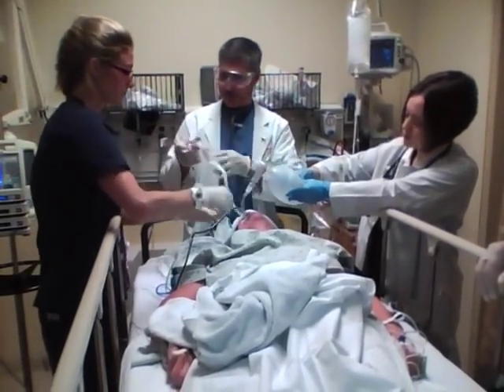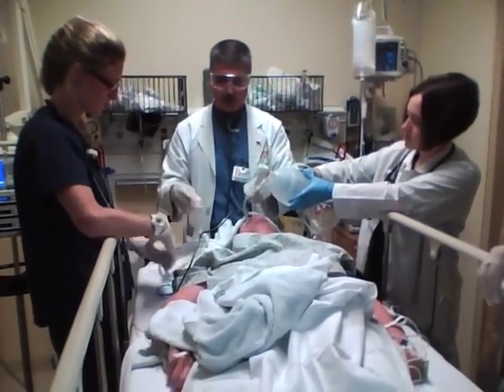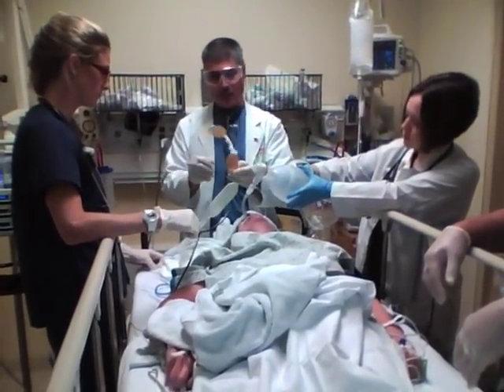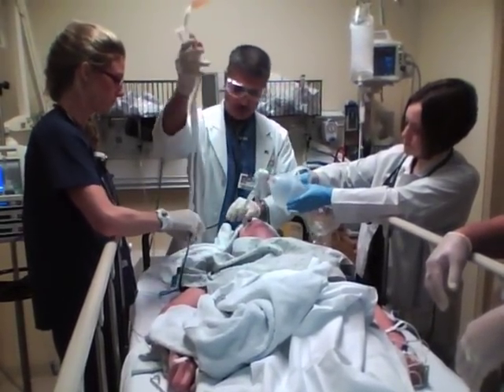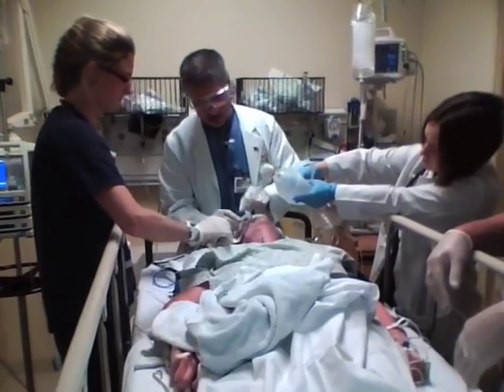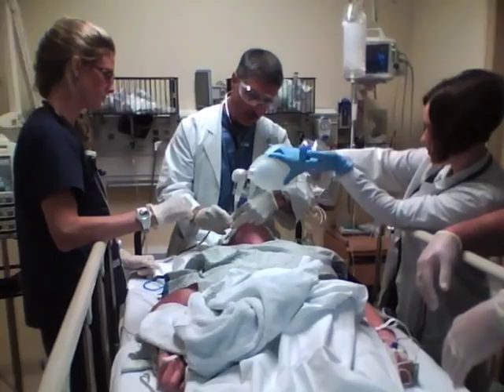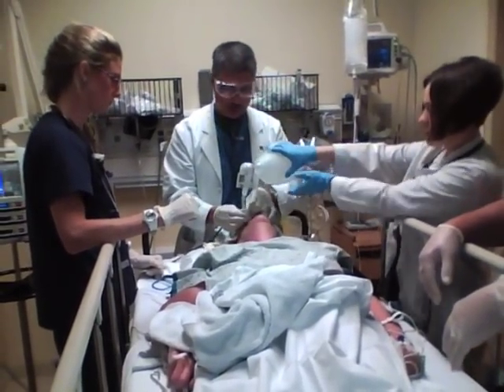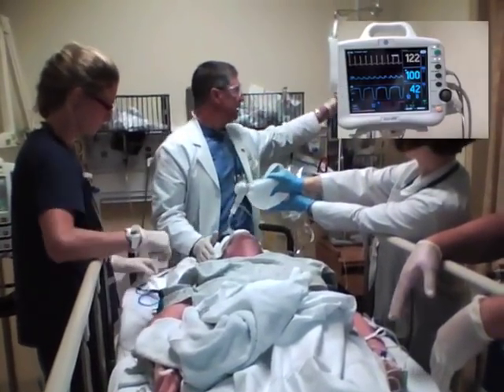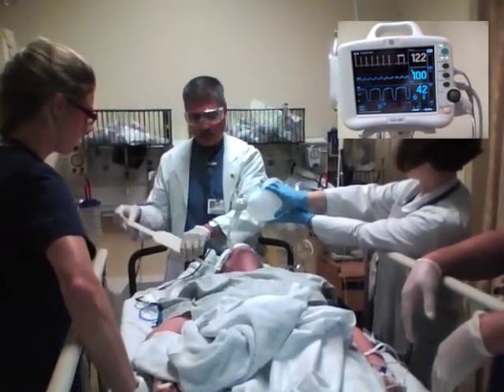Kate's got her tube tamer that we're going to use to secure the endotracheal tube. You take the stickies off of both sides, flip this around the NG tube which the patient happens to have in, and it locks in here. There's a little piece of tape here, and this will secure the ET tube in the right position. The only way we know this tube is in is to look at the waveform on the capnometer — if we don't see that waveform, we don't know it's in.